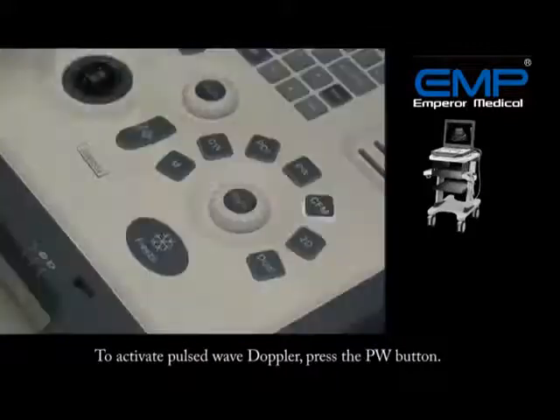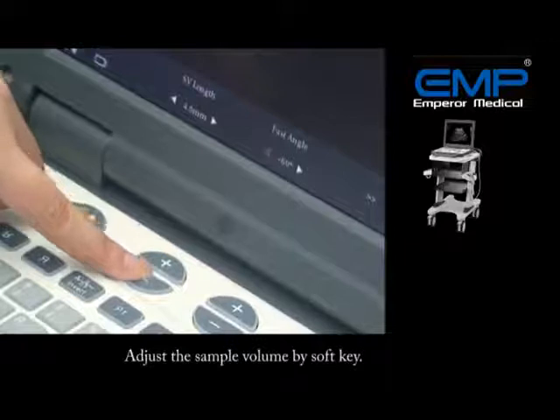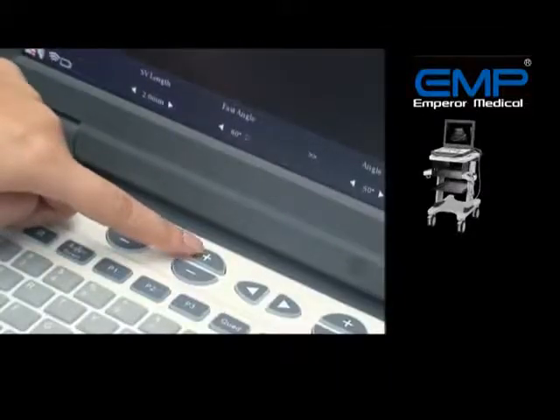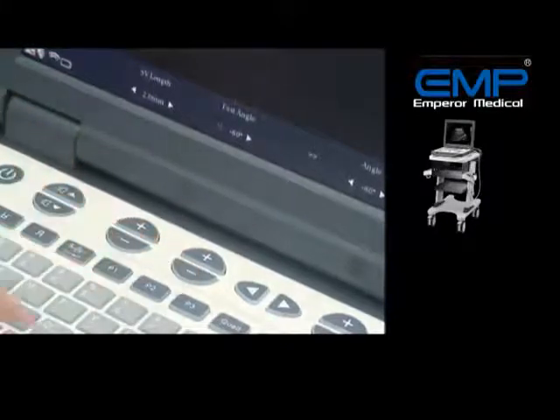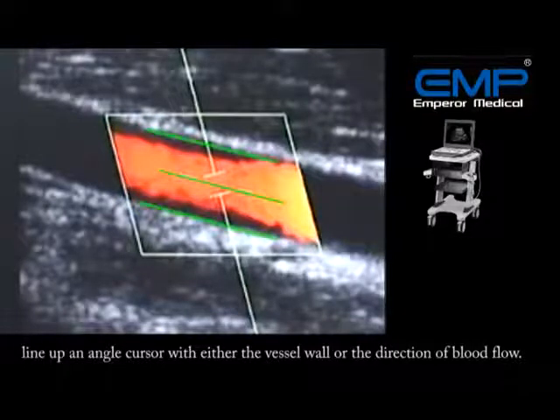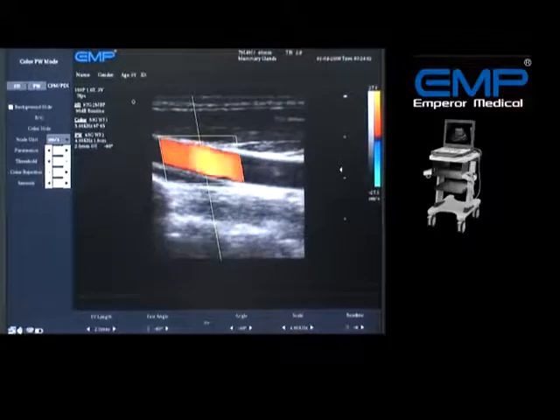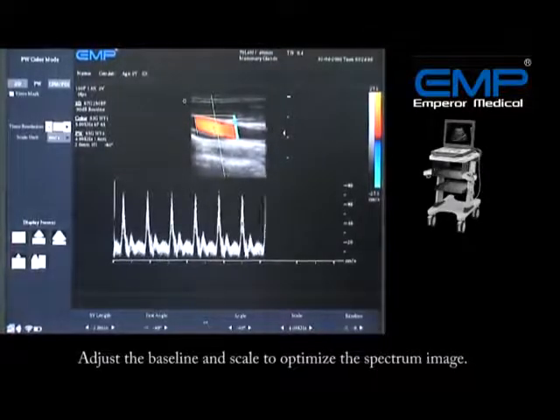To activate pulsed-wave Doppler, press the PW button. Adjust the sample volume by soft key — a proper sample volume length should be half to two-thirds of the vessel width. Adjust the angle correction cursor by soft key, aligning it with either the vessel wall or the direction of blood flow. Note that the angle correction should not exceed plus or minus 60 degrees. Press the Update button to activate the spectrum, then adjust the baseline and scale to optimize the spectrum image.